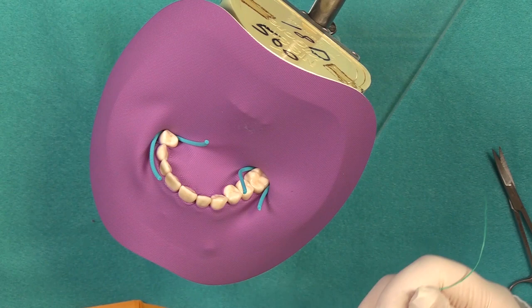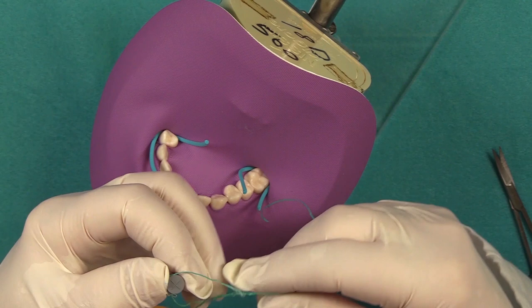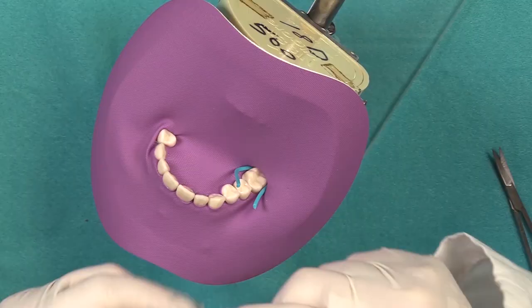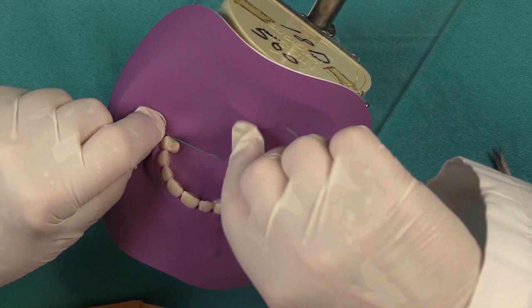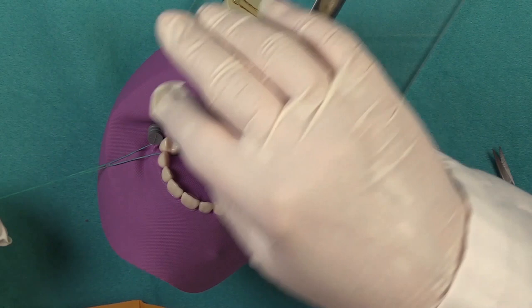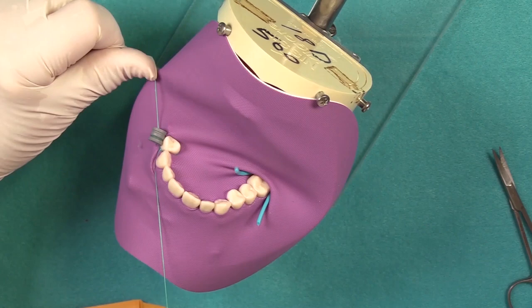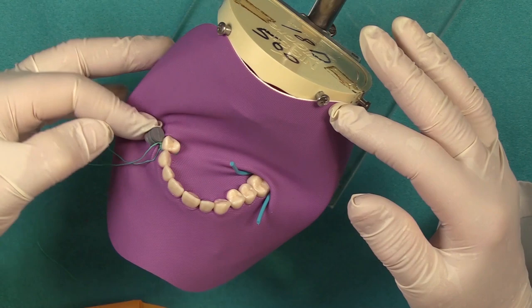Tighten it down around the plunger like that. Now this could work for like the last tooth in the arch for example. So the idea is that the plunger being bulky that it is would keep the dam from slipping off the tooth. So again, then you would do a surgical knot when you ligate it around the cervical area of the tooth, see like this, and then go ahead and knot it again. And then see this being bulky will prevent the dam from going beyond. Yeah the little plunger works very well.